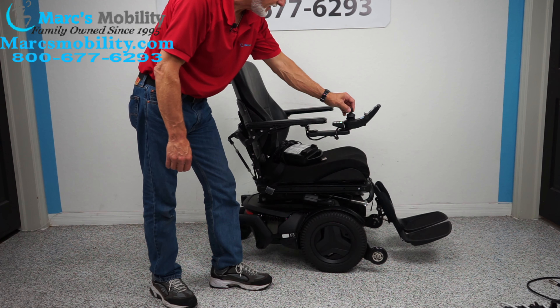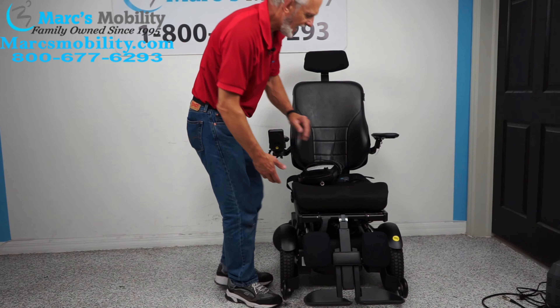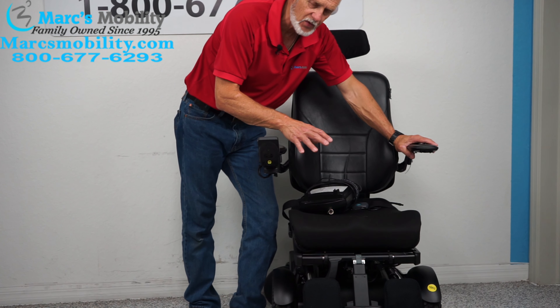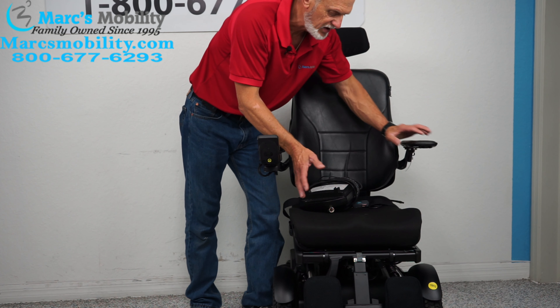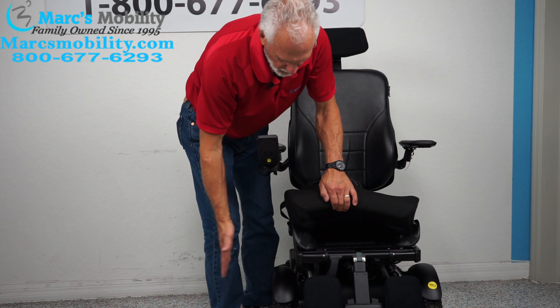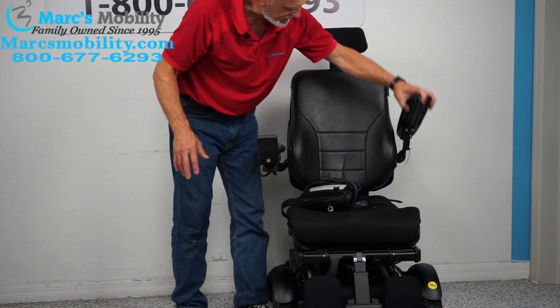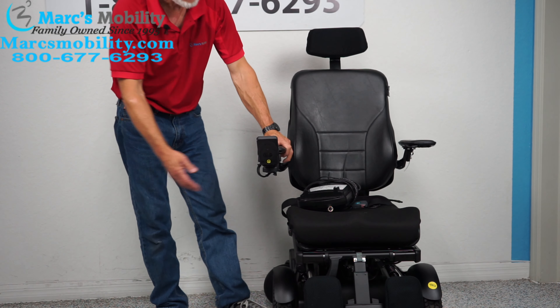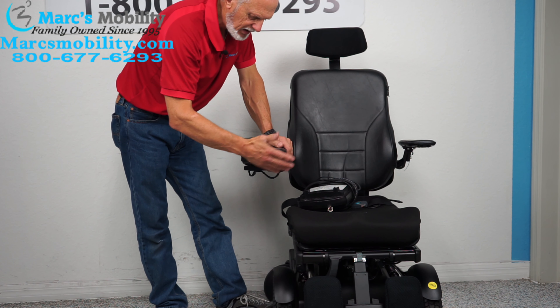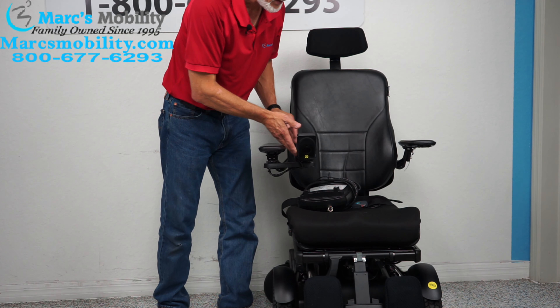The seat on this chair is 18 by 18, but these seats can be adjusted. If you need a larger seat — a 16-inch or 20-inch — we can take these cushions off, expand the railings out, and put a bigger or smaller cushion. We can adjust these chairs for you. You also have a swing-away joystick, so if you get to a dining table you can get a lot closer, and if you're left-handed, we can switch everything to the left side.